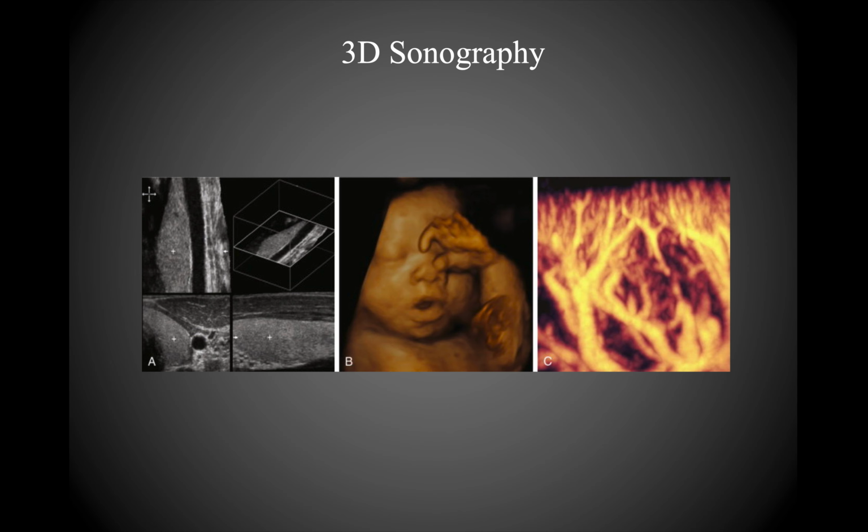Okay, so again, voids are going to look black, whereas the structures themselves that are sending that wave back to the ultrasound probe, those are going to appear white. So again, keep that in mind. Color, which again you've seen, is usually represented in the form of a heat map, so a lot of the time you'll see it red, blue, yellow, showing you the intensity and the directionality of the fluid that you're looking at in terms of how it's moving.